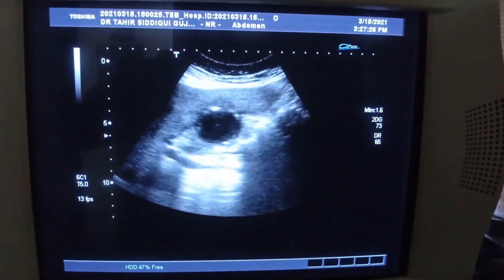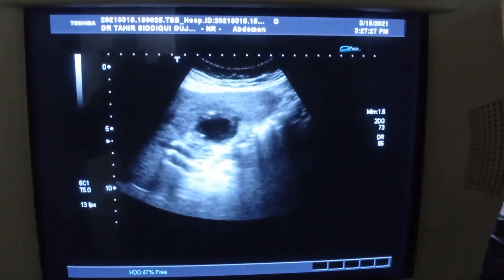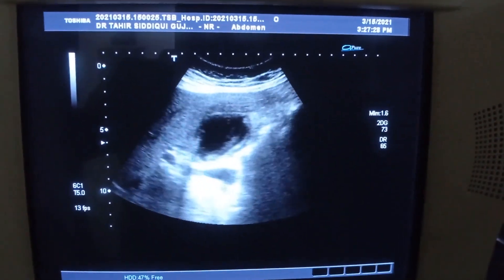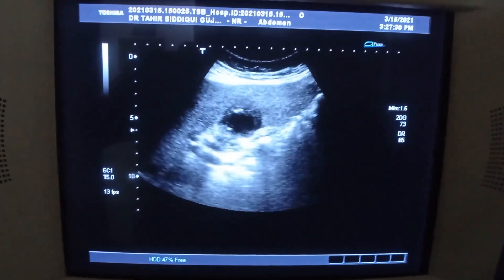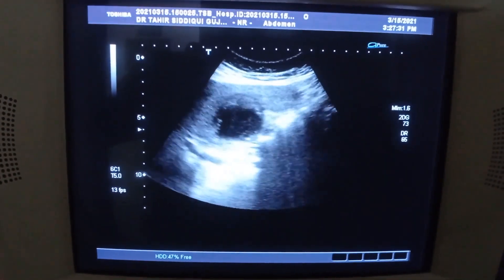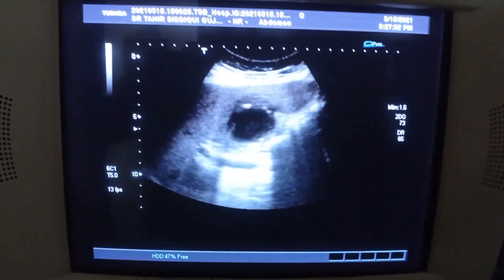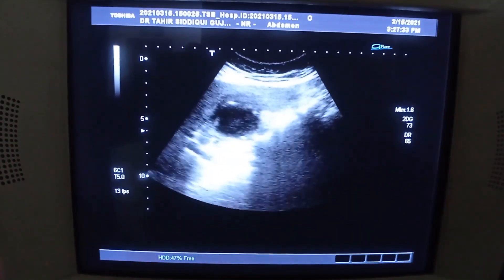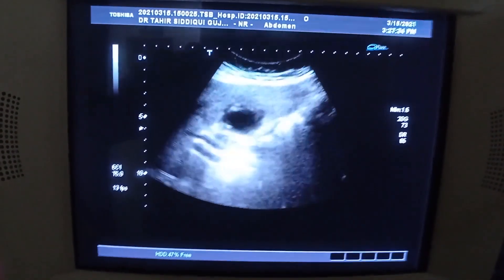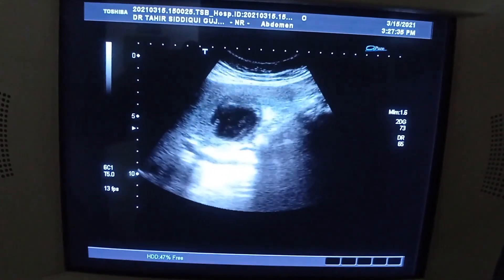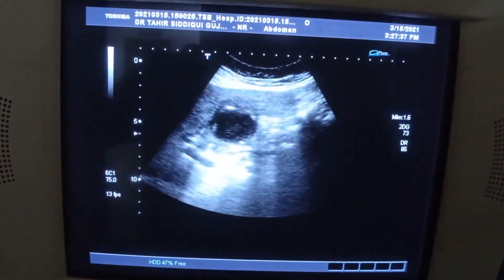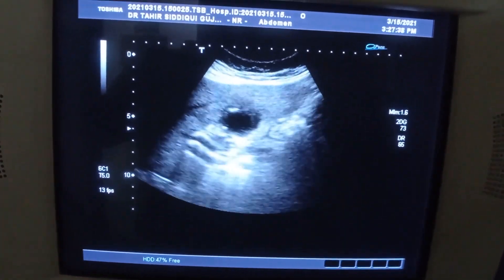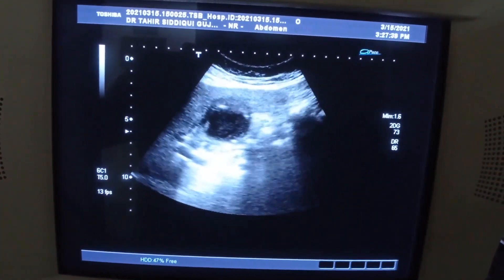Now I am focusing on the gallbladder of a 55-year-old female. She is not tender to probe and the region in front of you is the gallbladder.